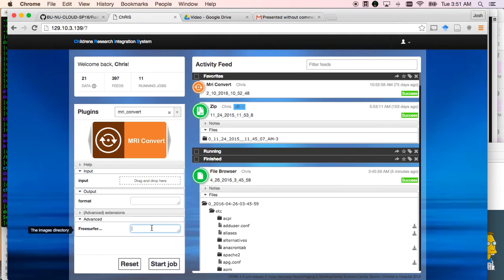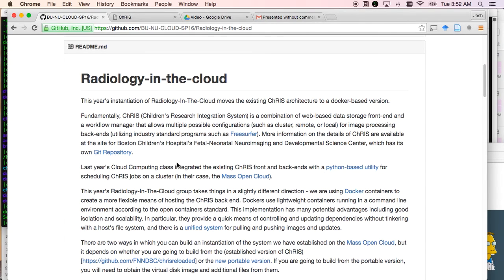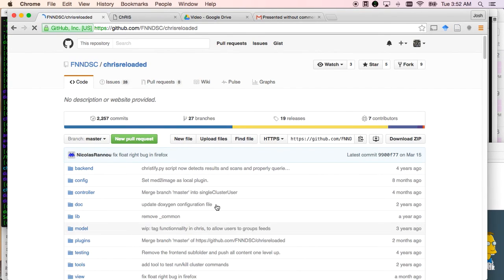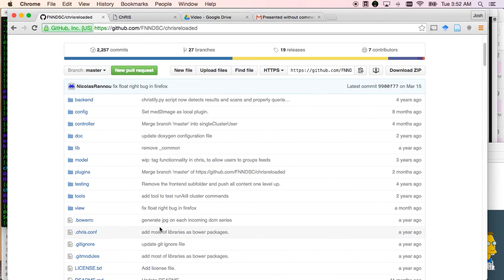Now, it's not simply as easy as doing something like this, but one of the objections is that you do have to at least be able to log into the system and know what you're going to damage. But part of the issue is that this code is available publicly online. And it's usually a safe assumption that if people can see your code, they're going to be, by definition, looking for holes in it.